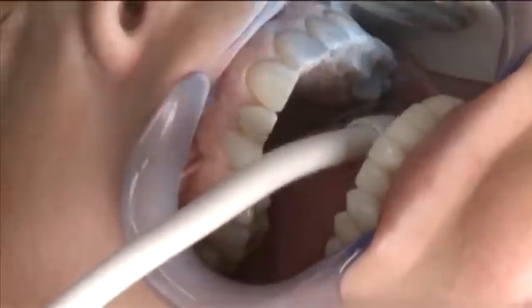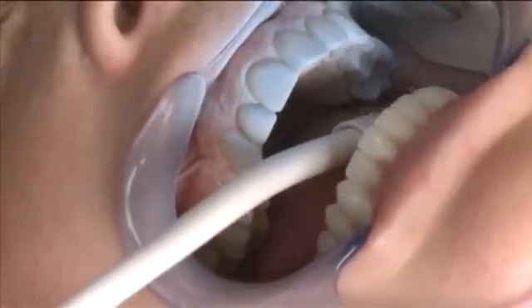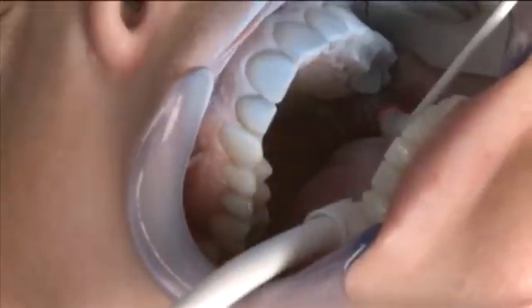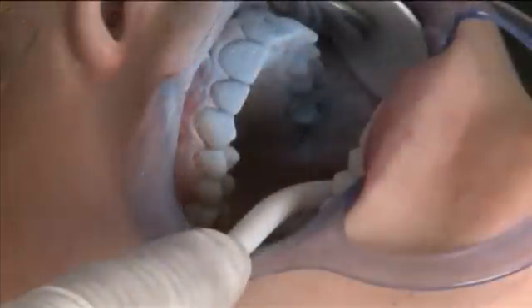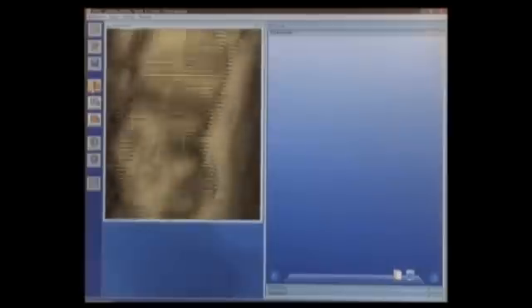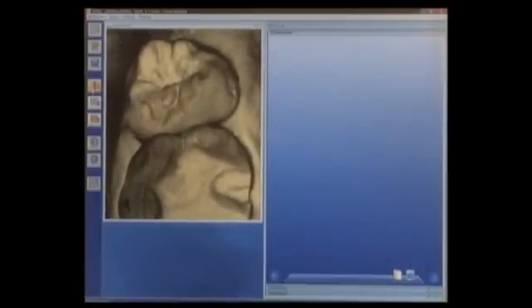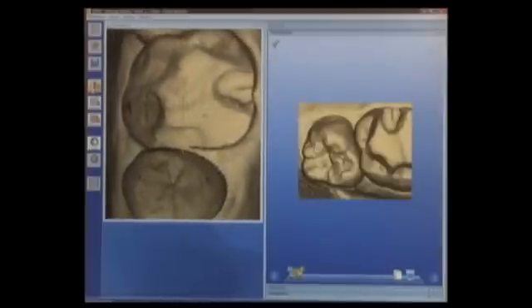Next we'll repeat that from the lingual, getting a little bit more here across the midline and going across the lingual. Now we're going to activate the camera in live capture mode and go all the way to the most distal tooth. And as I stabilize the camera, the first image will capture automatically and we'll see the model begin to grow on the screen.